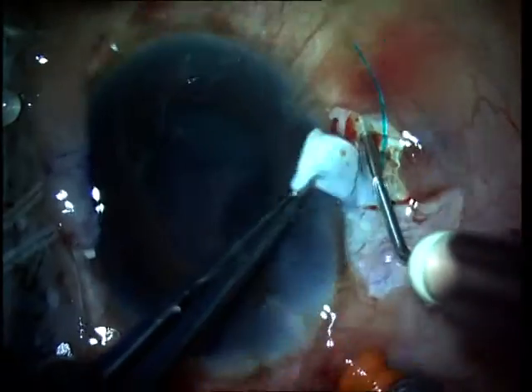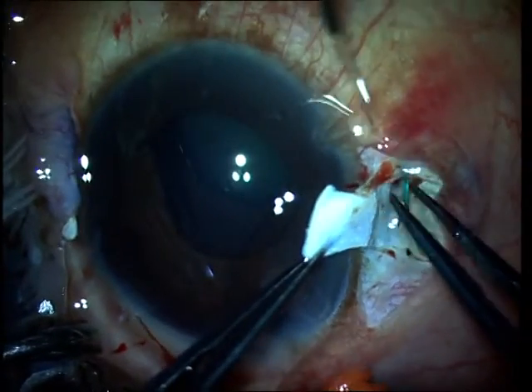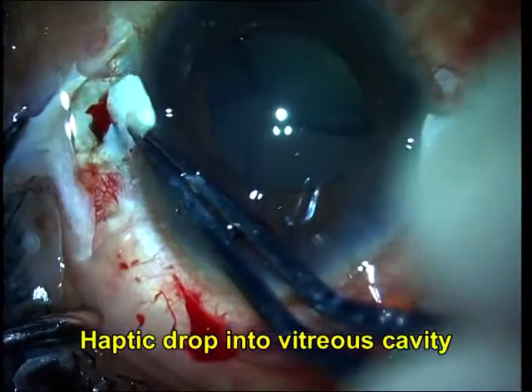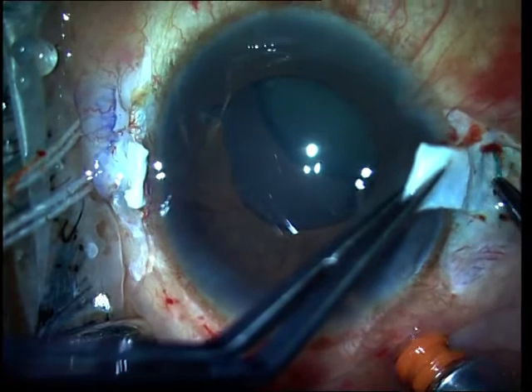As of now my intraocular lens is behind the subluxated lens. I have made the 26-gauge Shar-iath tunnels and have tucked the first haptic in, but to my dismay I realized that the second haptic has actually slipped back into the vitreous cavity.